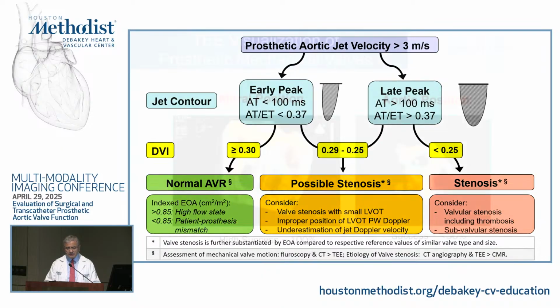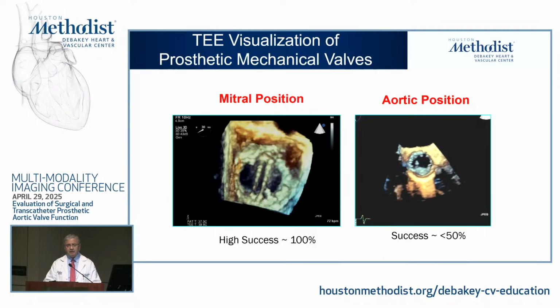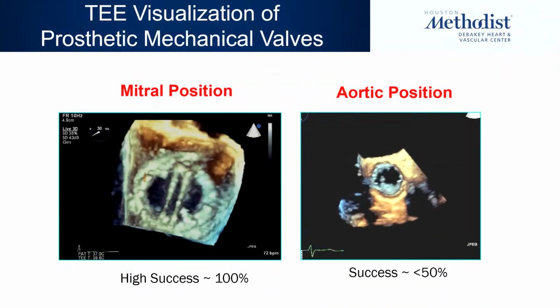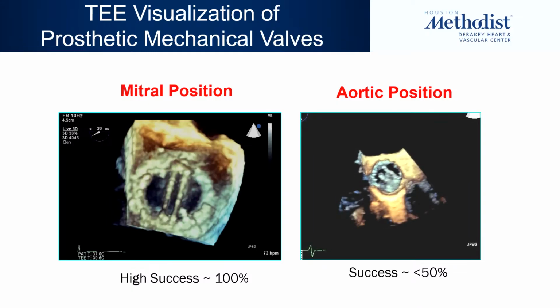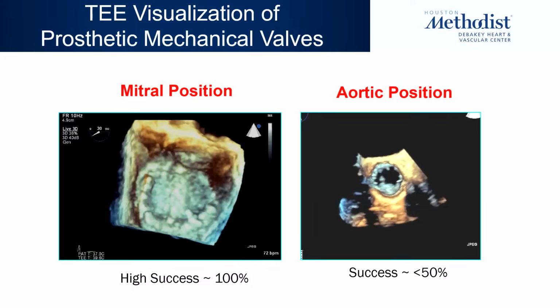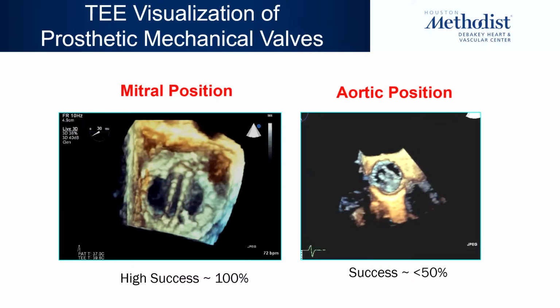And the reason for it, as you could see here, is I'm showing you among the better views. Most often you may not see actually well. You may see that it's moving, but in mechanical valves you may not be able to calculate the angle of motion of that valve and whether both of them are really moving very well.